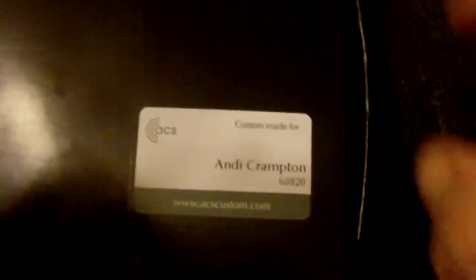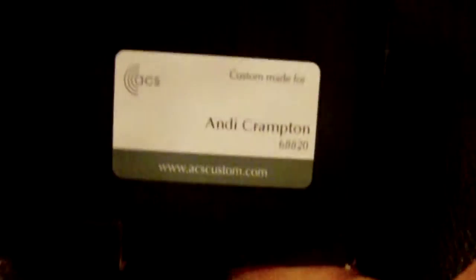What have we got here? Custom made, Andi Crampton — that can only mean one thing. Finally got round to the second part of the ACS video from the custom plugs.